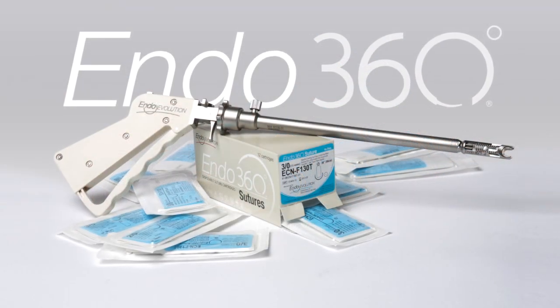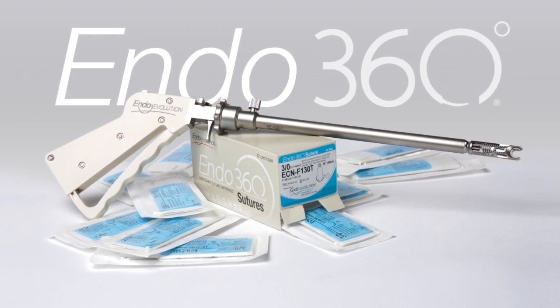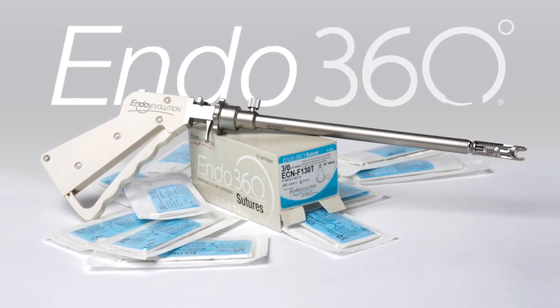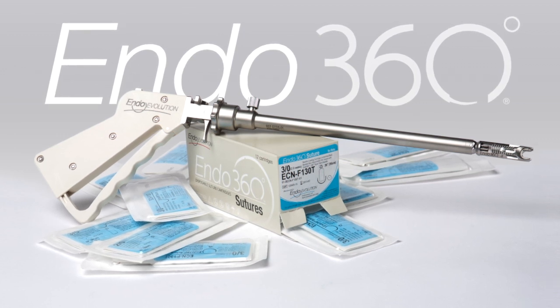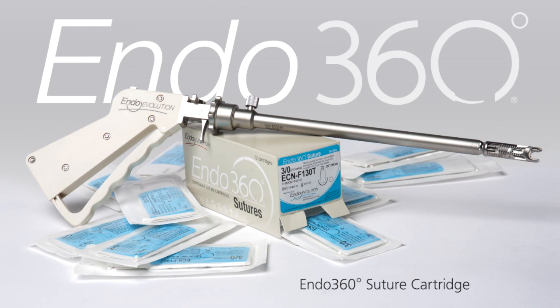The EndoEvolution Endo360 Minimally Invasive Suturing Device consists of two elements: a robust, ergonomic, reusable, stainless steel suturing instrument, and a single-use, disposable suture cartridge.